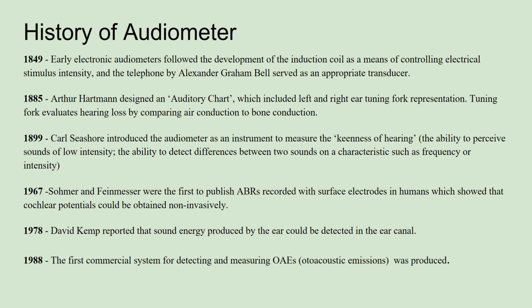So, let's talk about the history of the audiometer. Graham Bell's telephone invention was an important invention for clinical audiology because it was used as a transducer. And in the same years, in 1849, the development of the induction coil, which is used to control electrical stimulus intensity, was also important. The tuning fork, which helps to test the hearing of people, has an important place in clinical audiology, and it evaluates hearing loss by comparing air conduction to bone conduction.